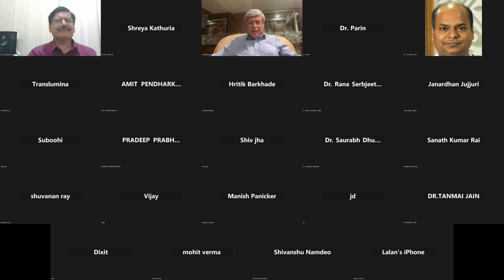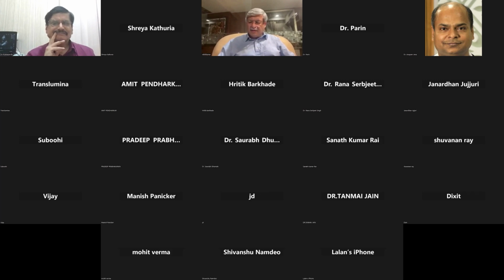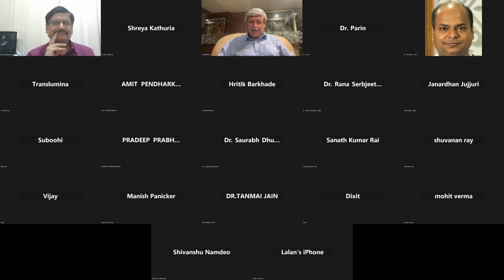Can we say it is important to use CT angiogram routinely before such patients? In fact, possibly if this patient had gone in for a CT angiogram, looking at the amount of calcium, one would have said very high calcium score, okay, we're not going to do a CT angiogram. People say that if it is more than 1000 Agatston, CT might not be very helpful. But in such cases, a good CT image could correlate with heavy plaque modification in the form of IVL or something, and that could be a good pointer.